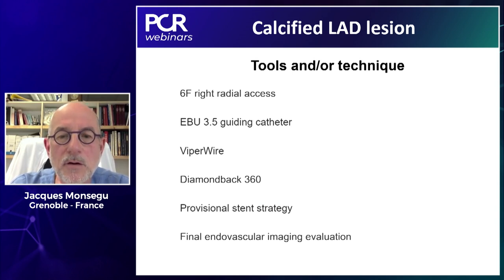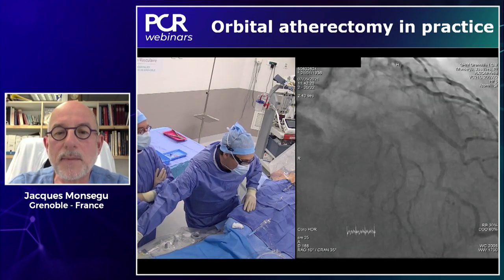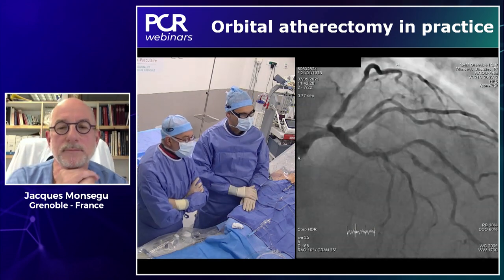And we do a final endovascular imaging evaluation with IVUS. We don't do that in routine, but for this case and for the educational procedure, we decided to use intravascular imaging. So I think we can go to the cath lab and see what we have done.